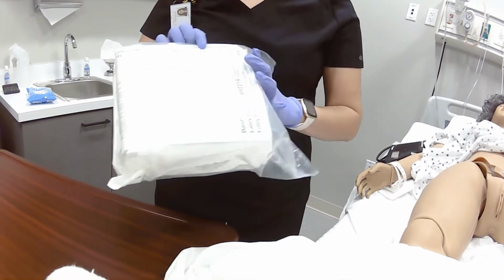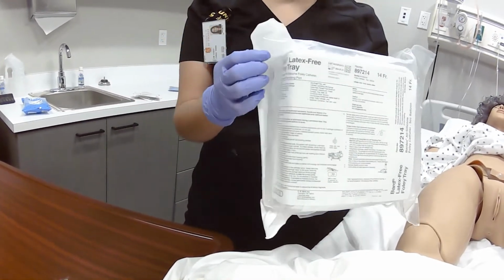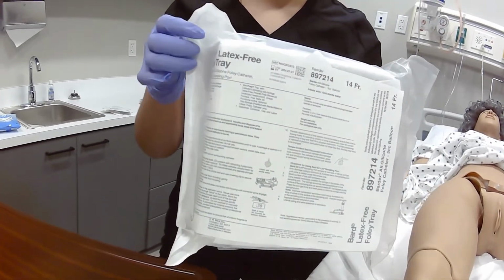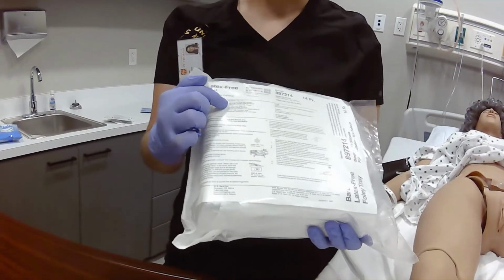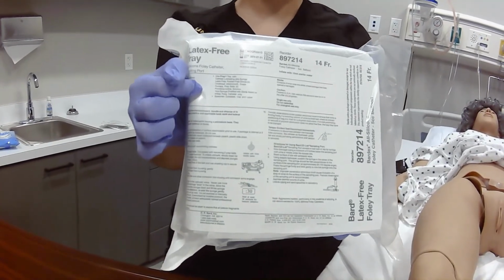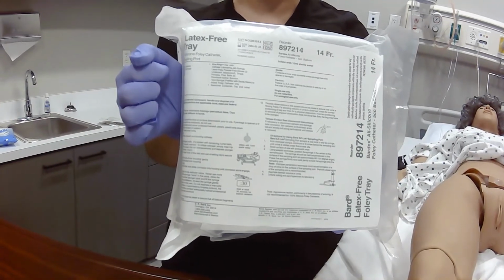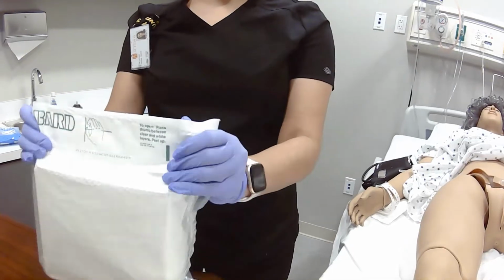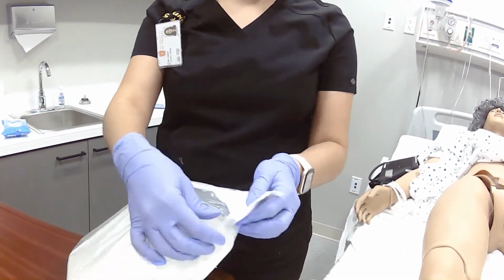Okay, so always look at that, and then also make sure that if your patient is allergic to latex, you get a latex-free kit. So you always want to verify what supplies are found in your kit, and that will be found on the outer packaging. Okay? Alright. So to start, we are going to open the Foley kit.